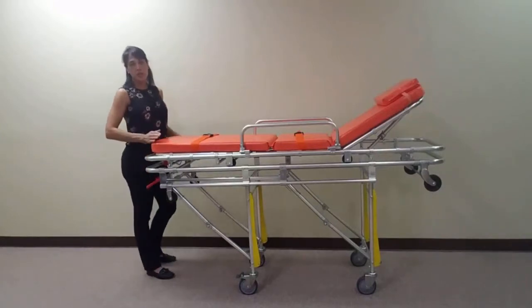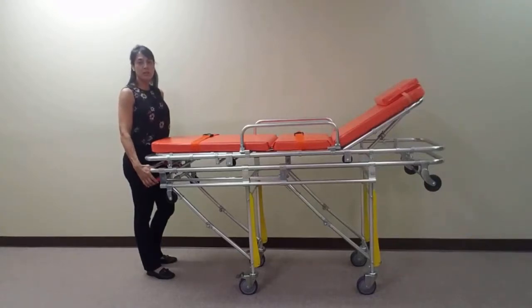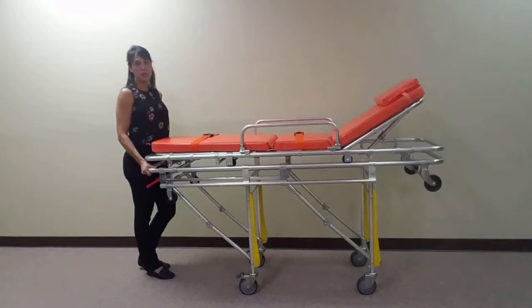To lower this unit, simultaneously squeeze both red levers located at the foot end of the stretcher and slowly lower the unit into a collapsed position. To raise the stretcher, just lift the stretcher up until the legs spring back into place.